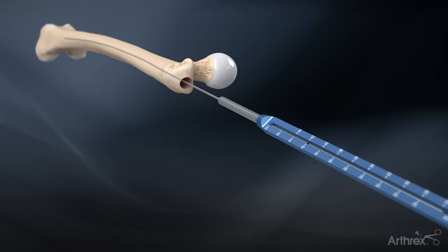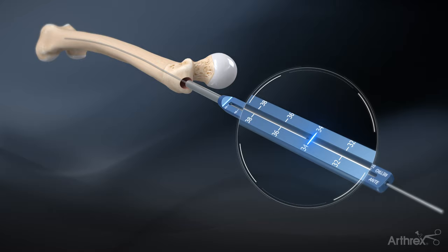Measure the length of the ball nose guide wire with the guide wire depth gauge from the laser etch line to determine the nail length.